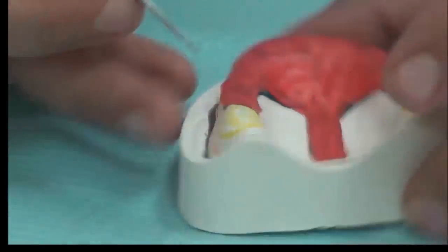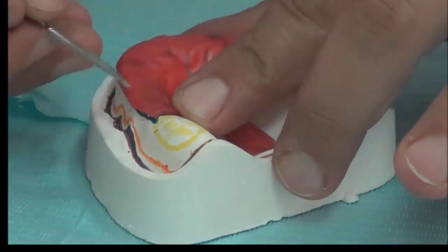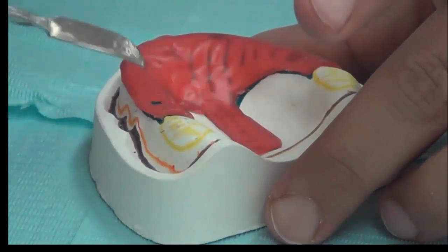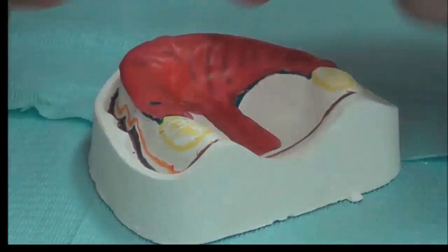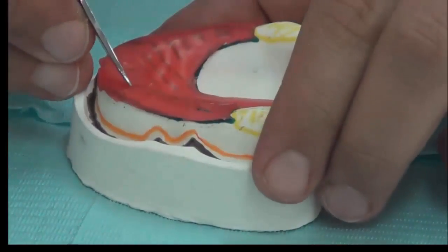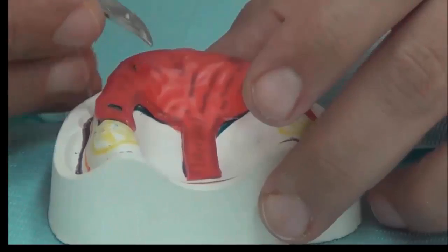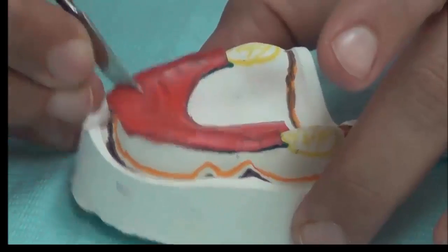So emptying a square shape over the crest of the ridge in the molar area and one in the canine area. So that tray material, as it's touching the support areas, it will touch just over here to maintain the space. If these stoppers are not there, the tray might tilt while taking the impression and we lose the space we have formulated or made in this cast. So tray material will stop here, maintaining the space.